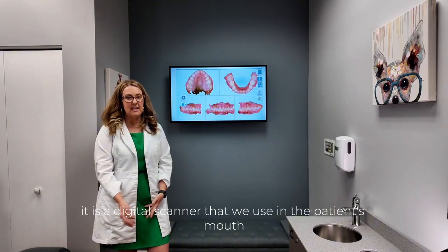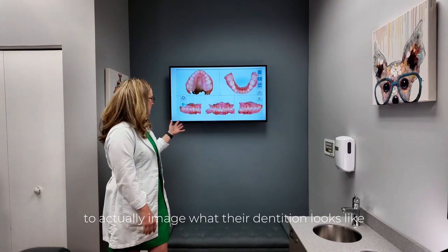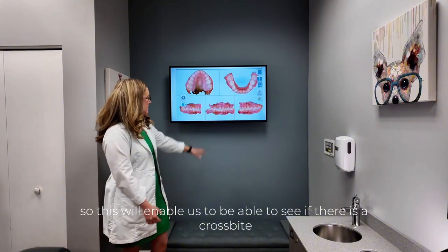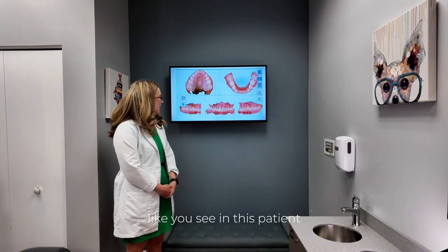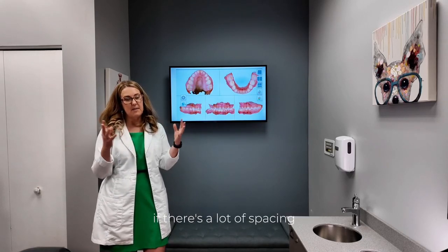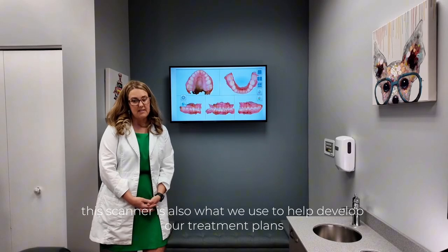The second part of our structural component of our evaluation is we take what's called an iTero scan. It is a digital scanner that we use in the patient's mouth to actually image what their dentition looks like. So this will enable us to see if there is a crossbite like you see in this patient, or if all the teeth are very crowded, if there's a lot of spacing. This scanner is also what we use to help develop our treatment plans.